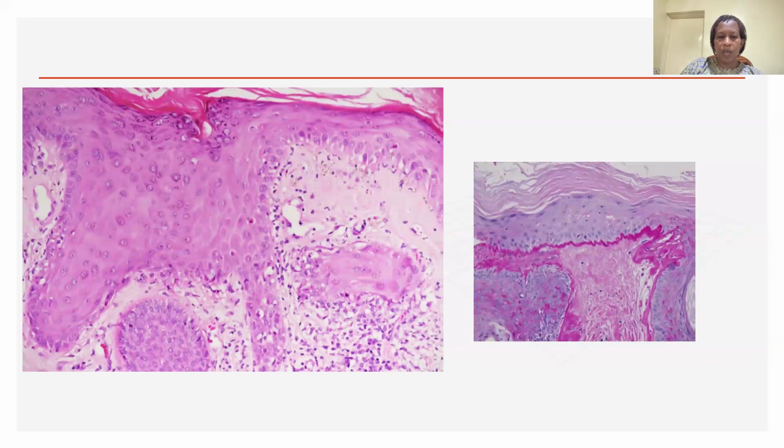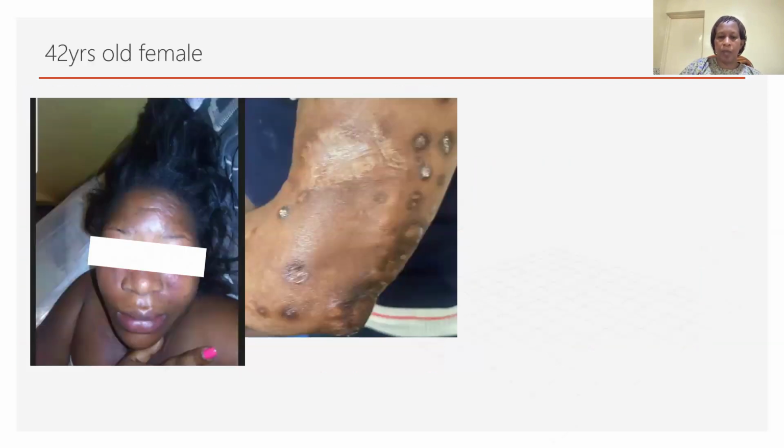We couldn't visualize a thickening of the basement membrane, so we ordered PAS staining of the case, which revealed the thickening of the basement membrane. And with this, discoid lupus erythematosus was confirmed, managed accordingly with hydroxychloroquine and topical steroid plus sunscreen.